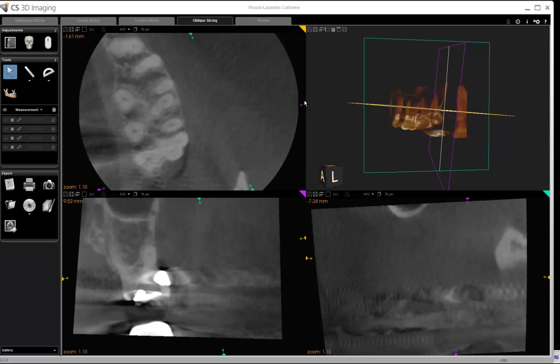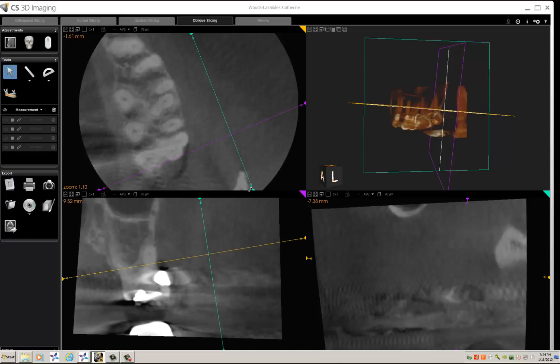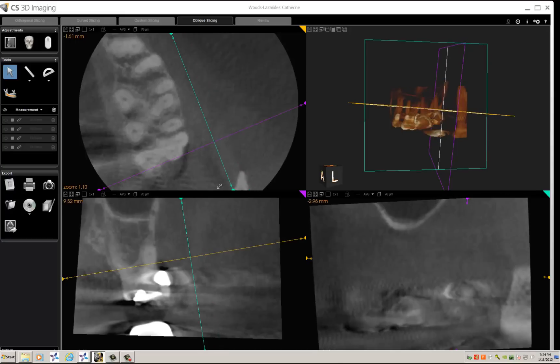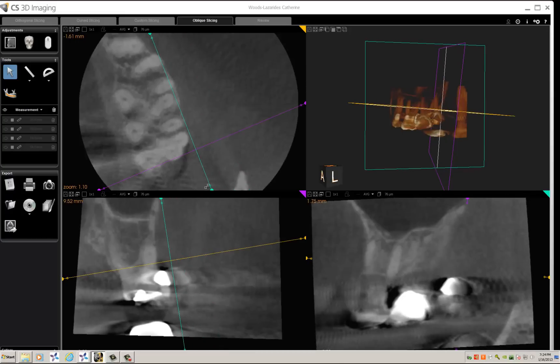Purple represents the coronal slice. Green represents the sagittal slice. Yellow is the axial slice. You take your orientation handles and manipulate them to the view that you need to do your measurement.